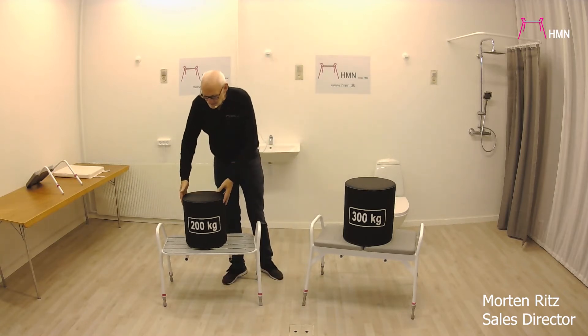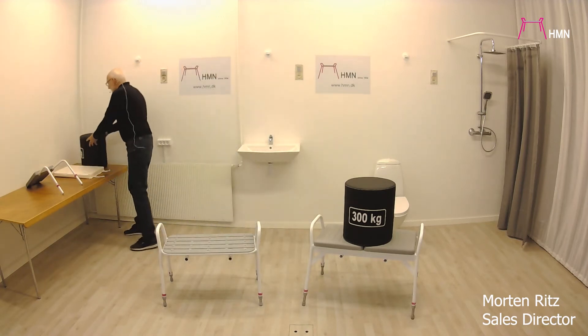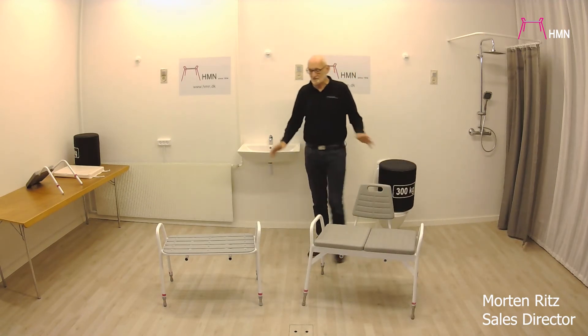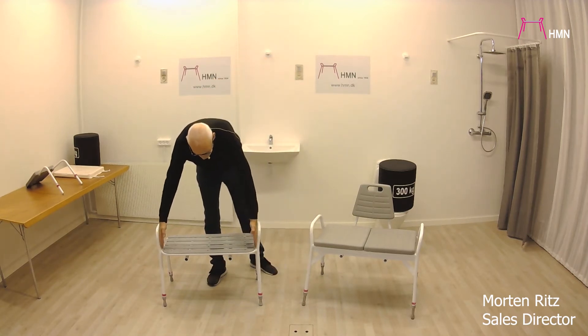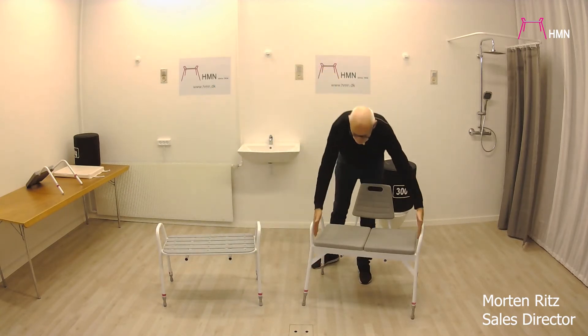One has a user weight capacity of up to 200 kg and the other one has a user weight capacity of up to 300 kg. Both of them are made out of stainless steel. The difference between these two, among other things, is the size — this one is 70 centimeters and this one is 75 centimeters.